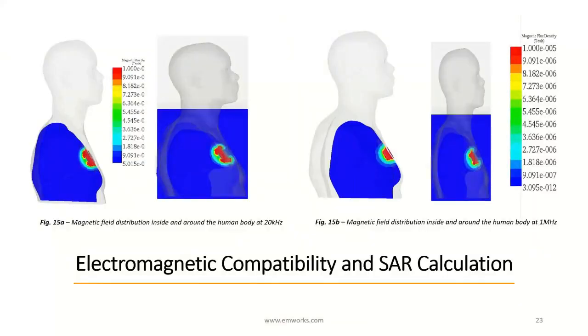The human body has very low conductivity, but it increases with the frequency. The simulations were performed at two resonant frequencies, which are 20 kHz and 1 MHz. Figure 15a and 15b show the magnetic field distribution inside and around the human body. It can be noticed that the field is stronger and covers a larger area at the frequency of 1 MHz.